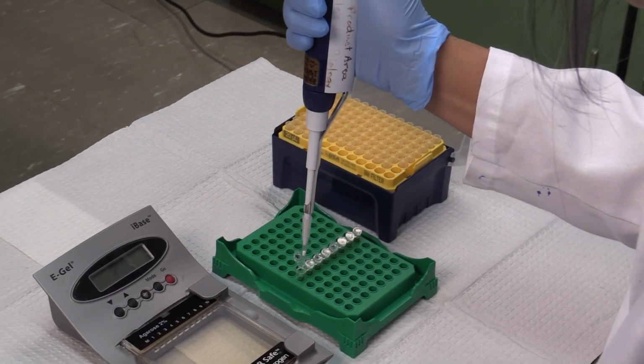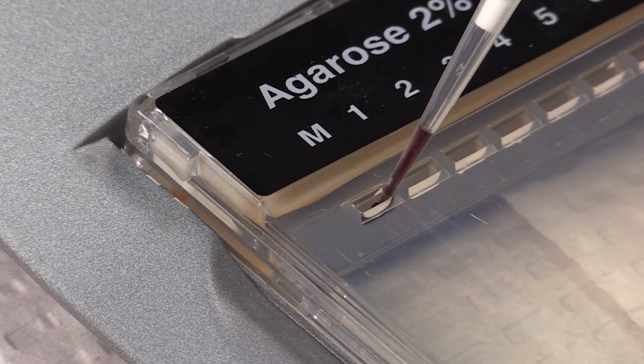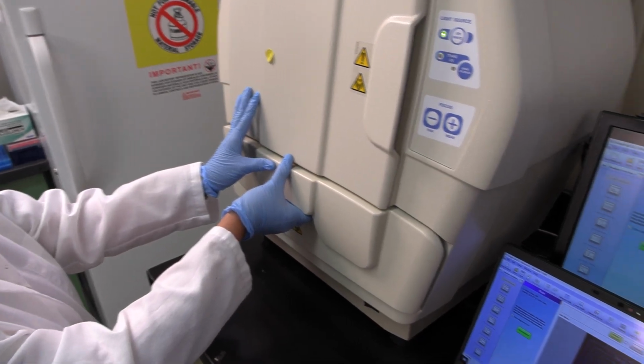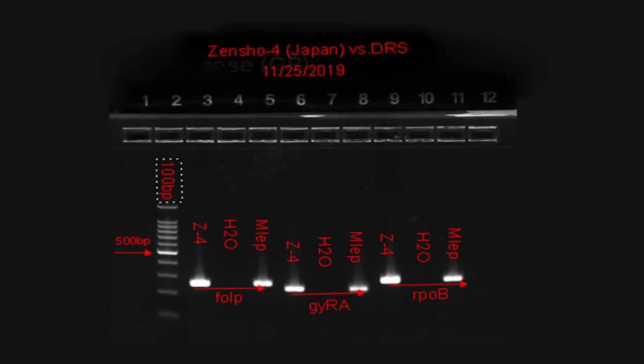If drug resistance testing is requested, the laboratory can use the same formalin-fixed, paraffin-embedded tissue to determine if M. leprae is resistant to rifampin, dapsone, or ofloxacin. Please note that drug resistance testing for M. lepromatosis is not yet available.